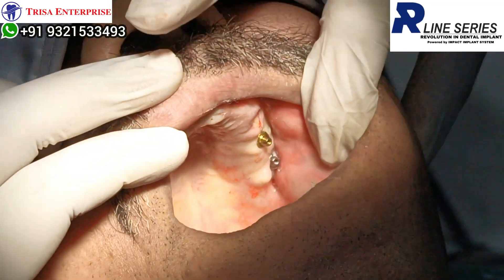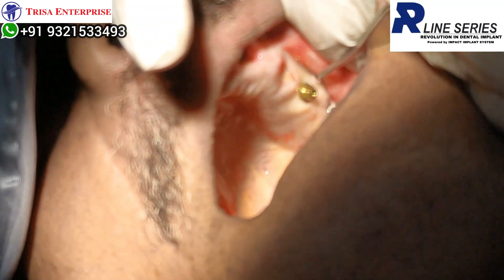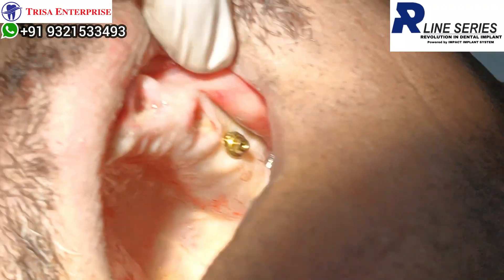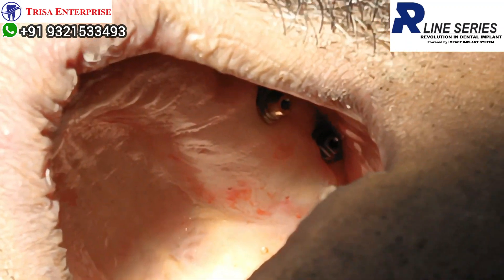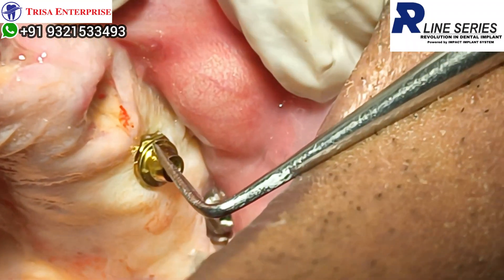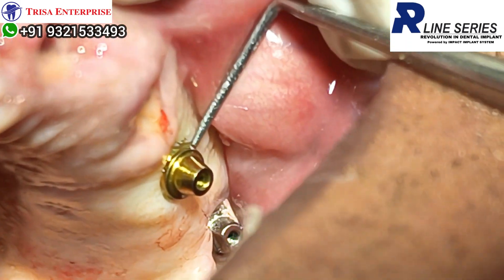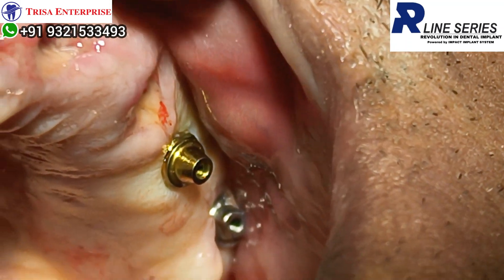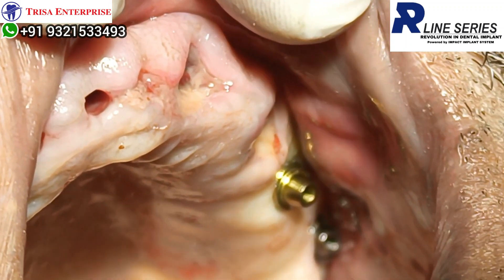Make sure when you are placing this implant that you are positioning the prosthetic margin correctly. Can you see this is the prosthetic margin? This is the prosthetic platform — this is where the prosthetic is going to come and sit. You try to flush it as much as possible with the gingiva, otherwise during your prosthesis this collar will be visible. It is a polished collar, but if you want to further enhance aesthetics, you try to keep that also submerged.